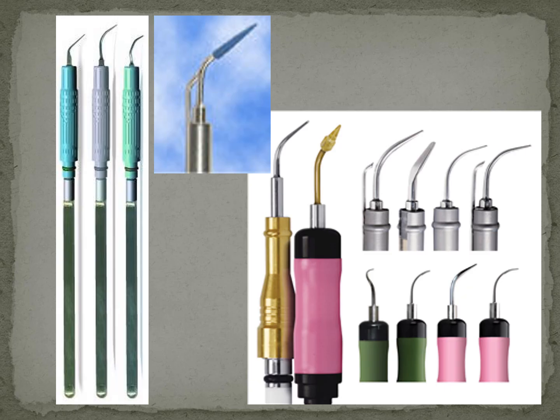So we always need to make sure that we have water coming out of our instrument. Okay, so it also needs to be water in between that tip and the tooth, because sometimes it's not the tip that's going to get hot, but it's the friction of the movement against the tooth surface that's going to get hot. And yes, we can cause pulp damage if we heat up that tooth too much.